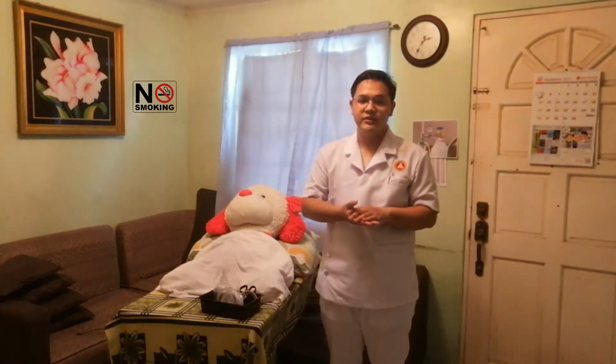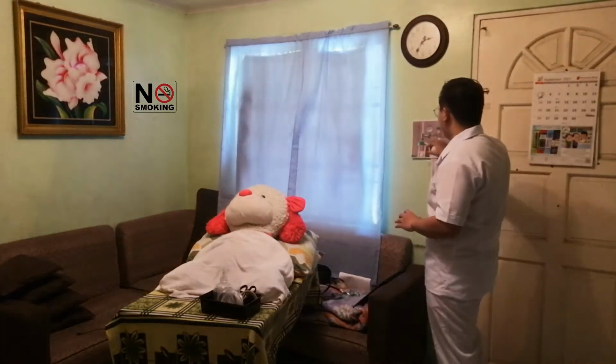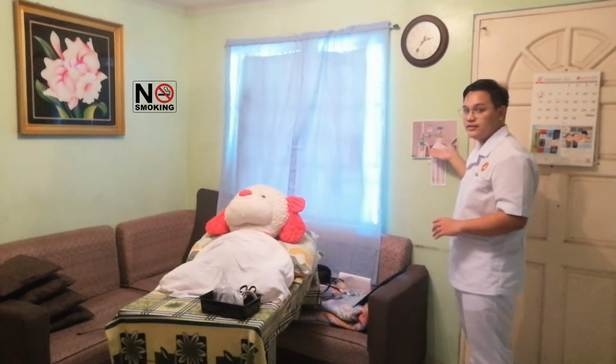Okay, so for our next step, we will now be setting up the equipment, the oxygen equipment and the humidifier. Okay, so what we're going to do, we will need first to attach the oxygen flow meter to the oxygen tank, or to the wall outlet. And we need to make sure that it is in the off position. Okay, so as you can see here, I have already put the flow meter into the tank.